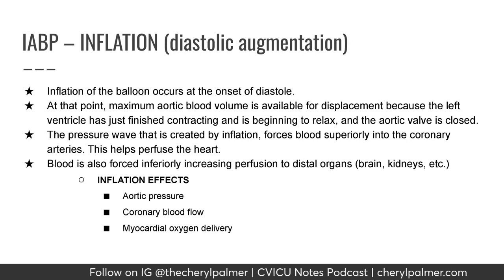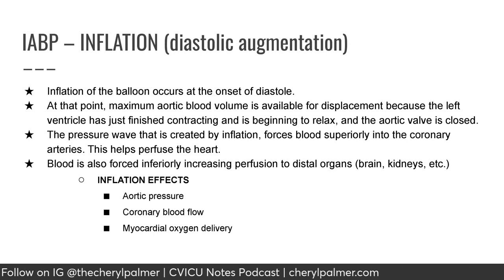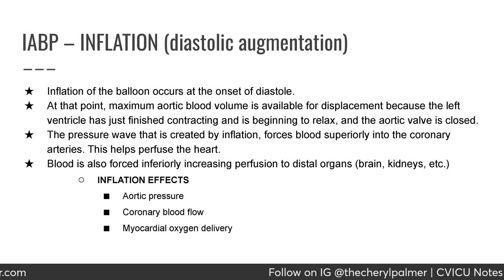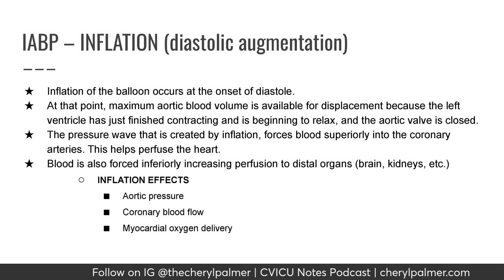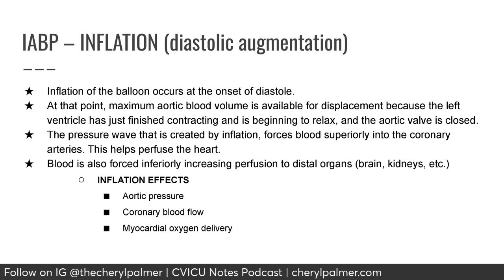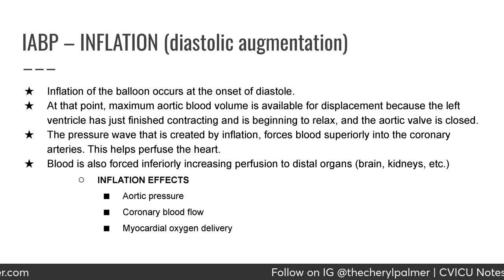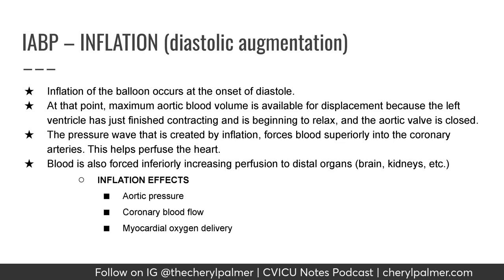The pressure wave that is created by the inflation forces blood superiorly into the coronary arteries. This helps perfuse the heart. Blood is also forced inferiorly, increasing perfusion to distal organs, the brain, kidneys, etc. Inflation affects aortic pressure, coronary blood flow, and myocardial oxygen delivery.